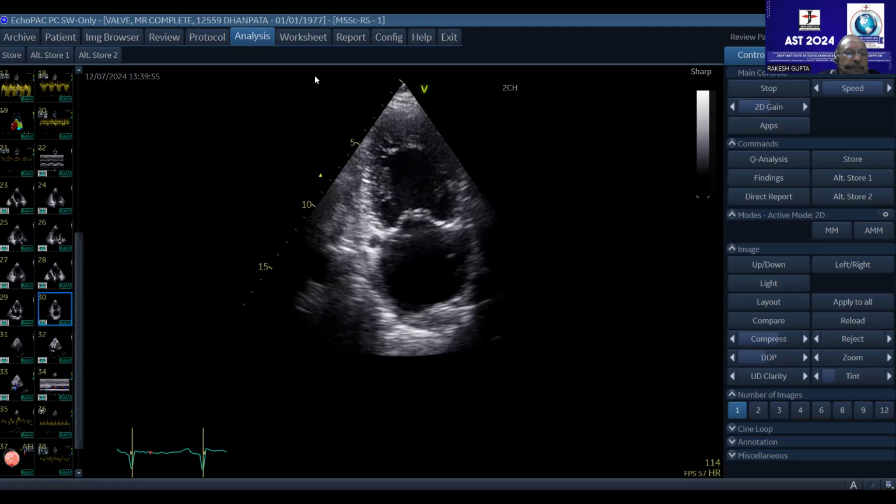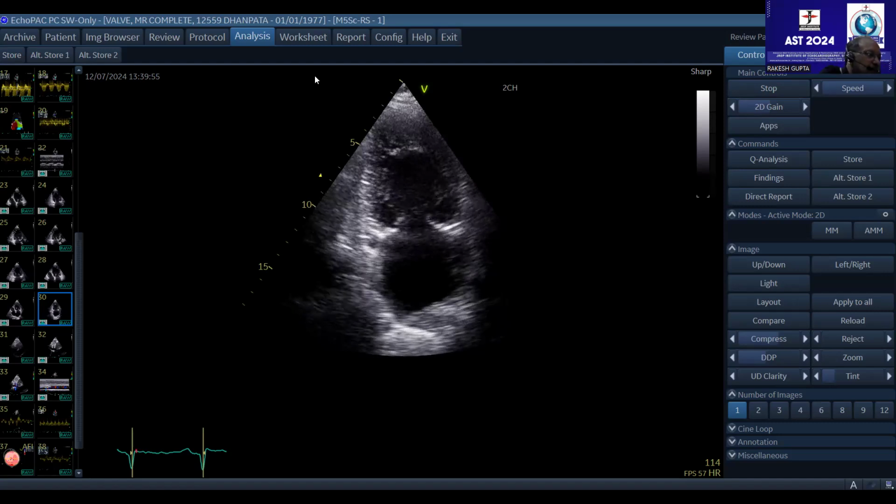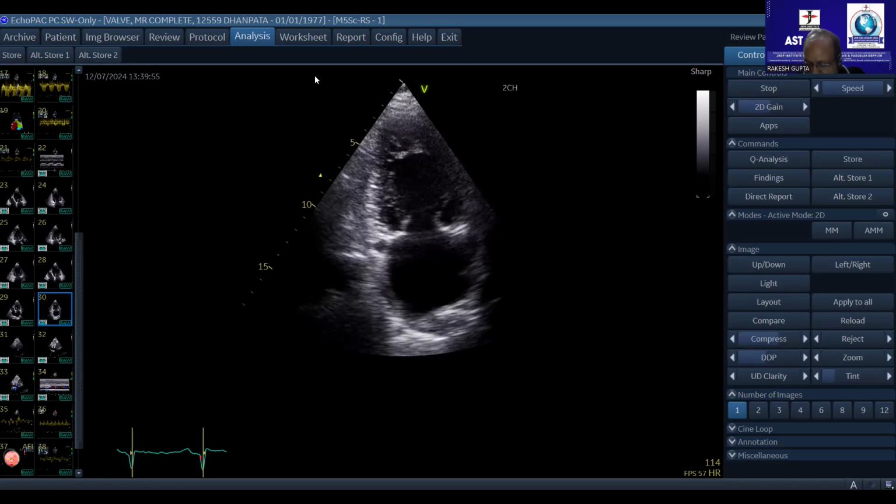Sir, I didn't get your question. Can you ask it again? My question is, what all parameters did I show you for mitral regurgitation? I have seen the dilated LV and dilated LA, sir. Okay. What else?